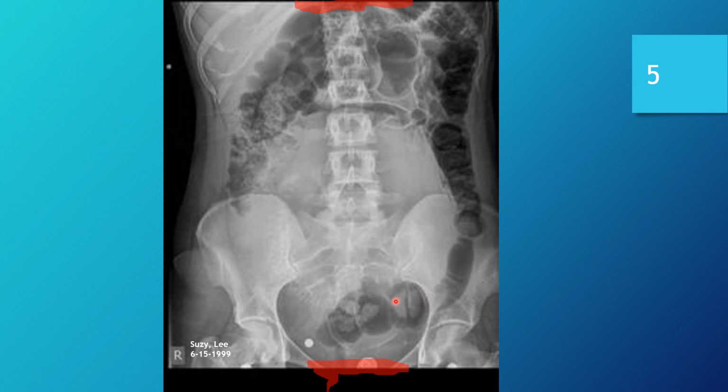It's just located centrally. So that leads me to believe that this patient is lying supine, and that the stool material, the fecal material, is actually resting against the posterior aspect of the intestinal wall there. So yes, this is a supine image.